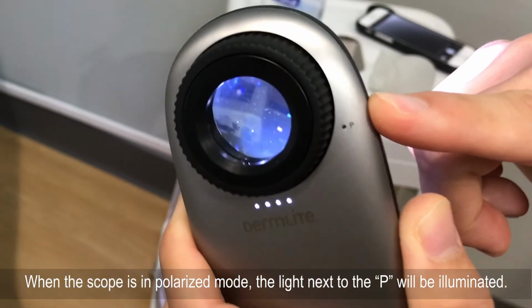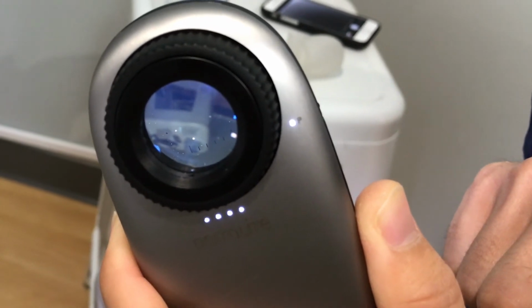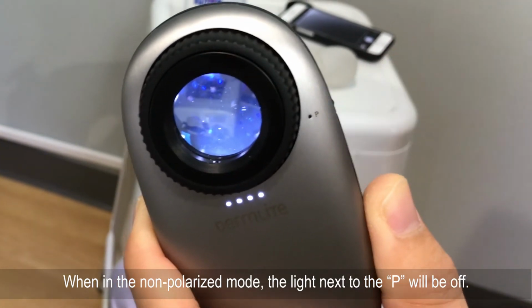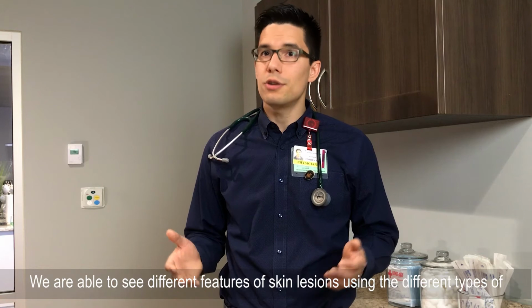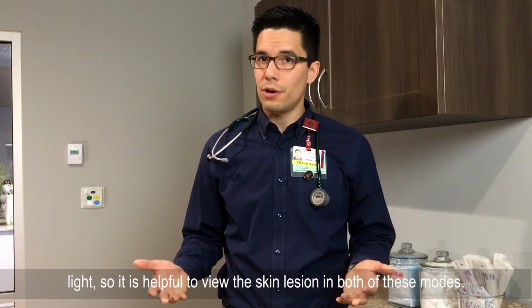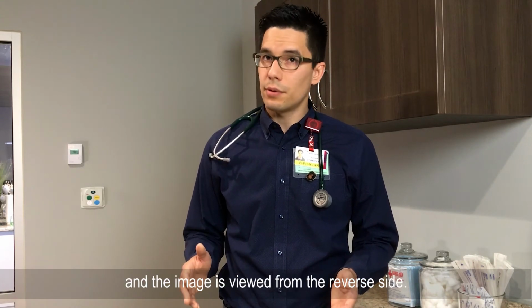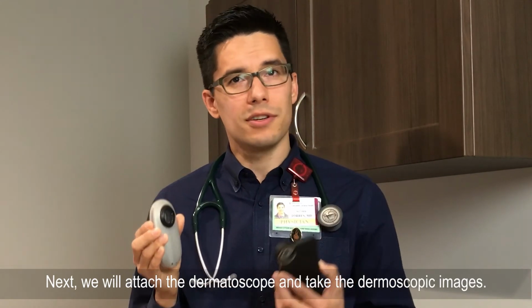When the scope is in polarized mode, the light next to the P will be illuminated. When in the non-polarized mode, the light next to the P will be off. We are able to see different features of skin lesions using the different types of light, so it is helpful to view the skin lesion in both of these modes. The LEDs will shine on the patient's skin, and the image is viewed from the reverse side. Next, we will attach the dermatoscope and take the dermoscopic images.